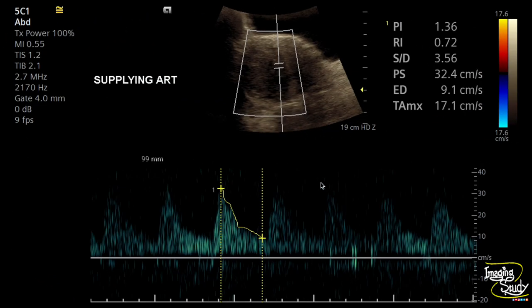Here we have taken a spectrum from the supplying artery, which is showing a moderate resistant flow pattern. The resistive index is 0.72. If you check our previous videos on fibroid uterus, you can understand what resistive index we commonly get in a fibroid and what we get in a degenerative one — so don't forget to check them.